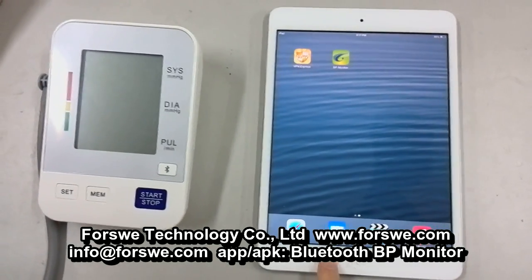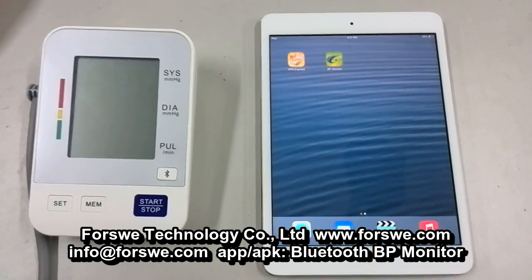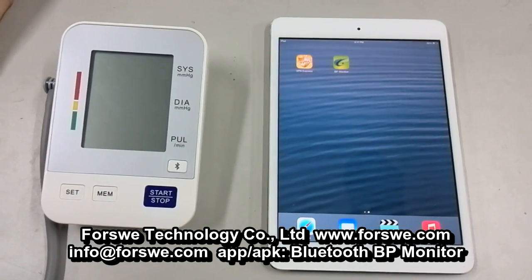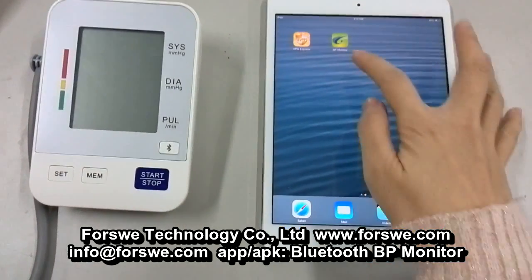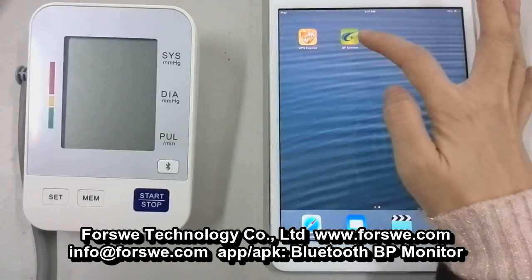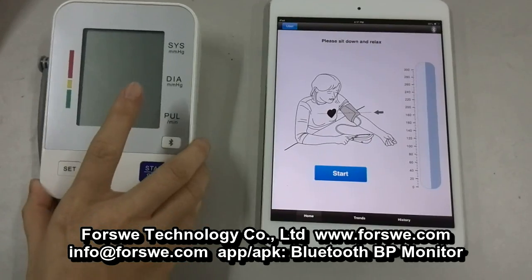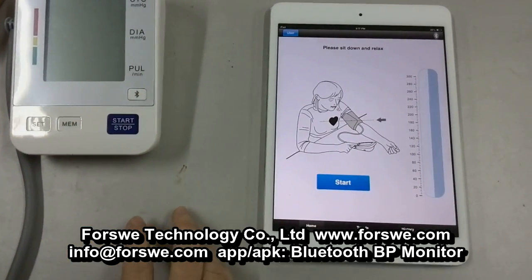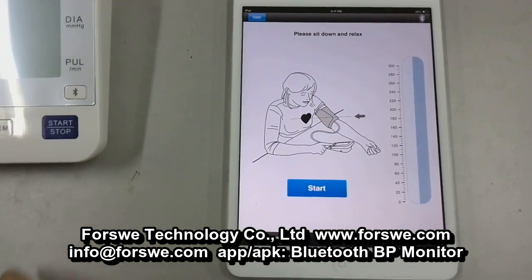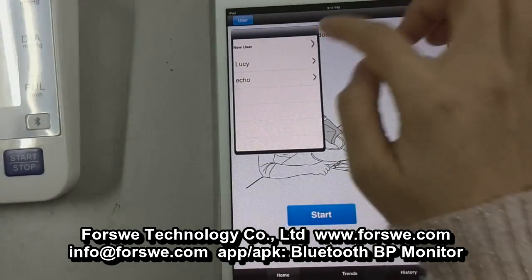This is the iPad. You have to download an app from the Apple Store. The software's name is Bluetooth BP Monitor. Now click into the home page. If you don't have a user account, you have to create a new one. Press the button User and choose New User.